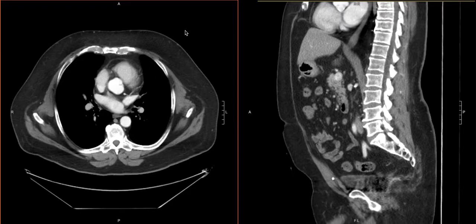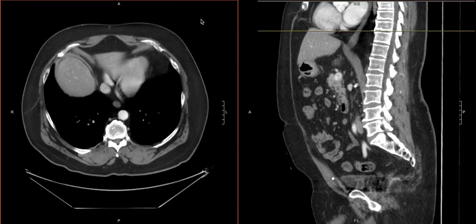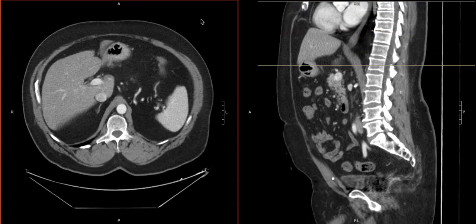And to do this, basically you come to the top of the scan, and then personally I divide the soft tissues into 4 quadrants, kind of, anterior, posterior, right, left, just like it's labeled here. And I actually start with the anterior surface because it seems like that's where most of the pathology is. So as you start at the top, you just scan down slowly, looking at the anterior soft tissues.